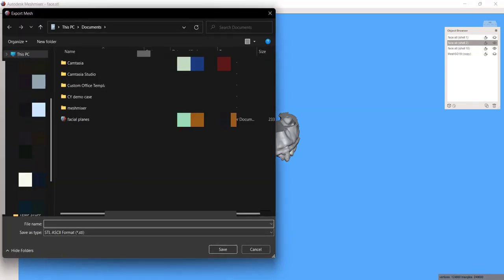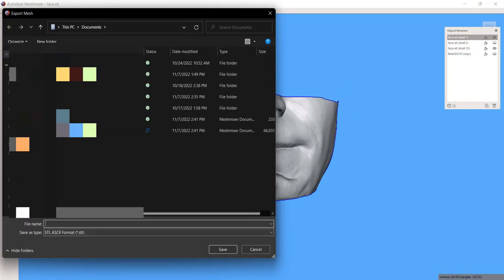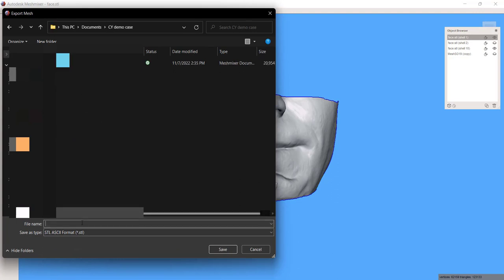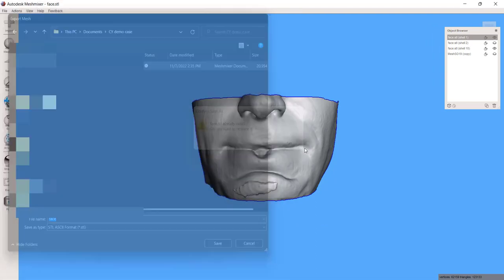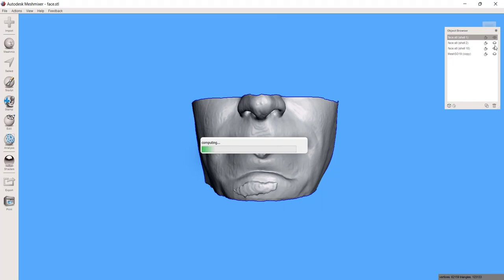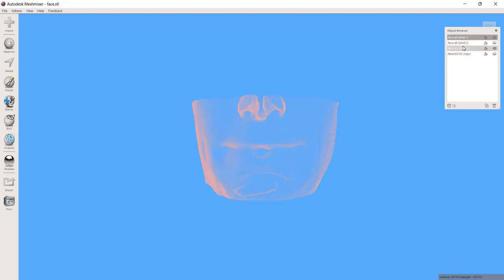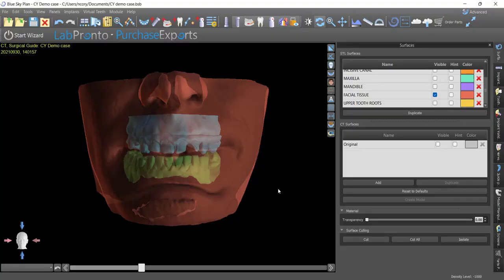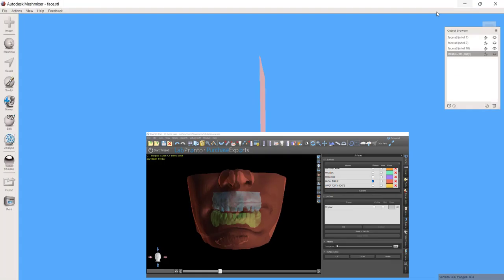I'm going to combine the two of these files and now export them, calling them facial planes. Here is my maxillary model, here is my facial model. And I can just overwrite what I called face earlier. Now I just need to find that opposing, which it looks like I managed to delete, so I'm just going to re-export that from Blue Sky Plan.